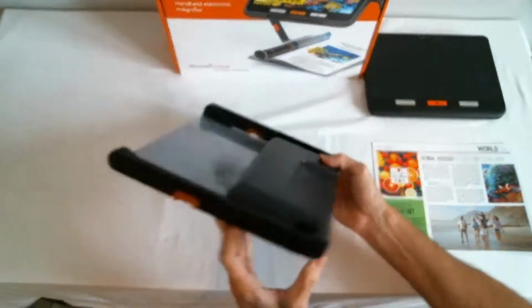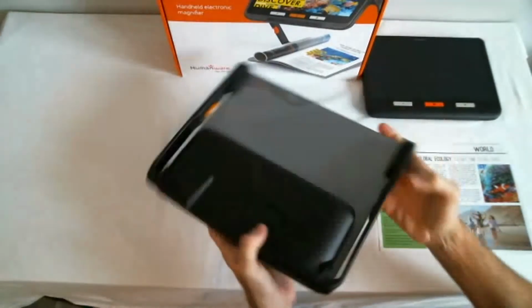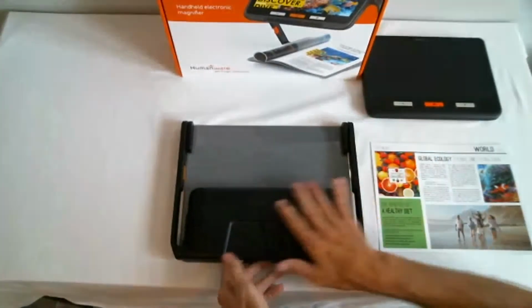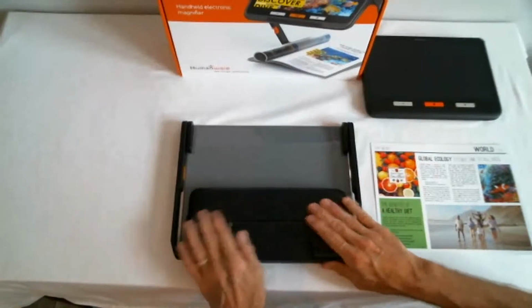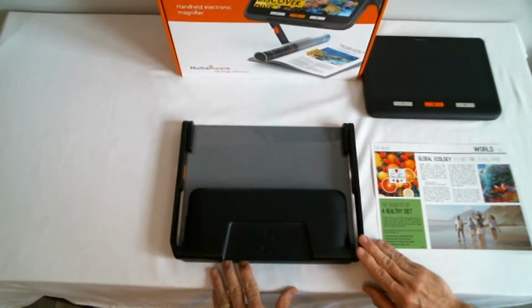I'll lift it up here, turn it sideways. You can see there's arms with an orange notch on either side. And then there's this black section here. That's the device tray where the explorē 12 will reside once the stand is opened up.